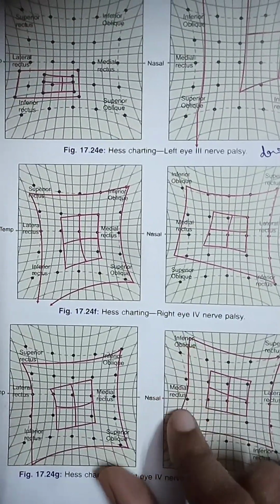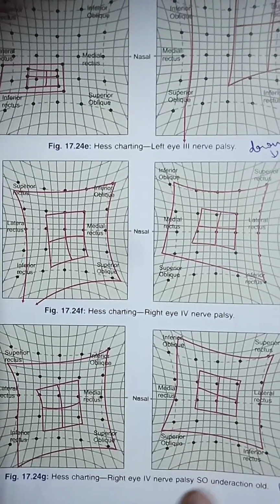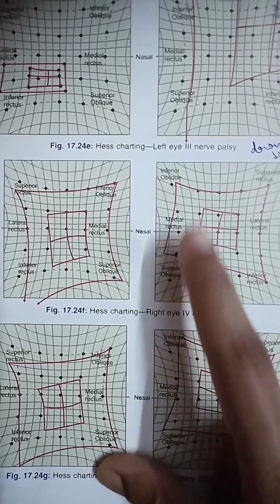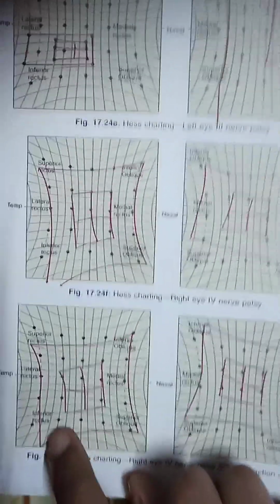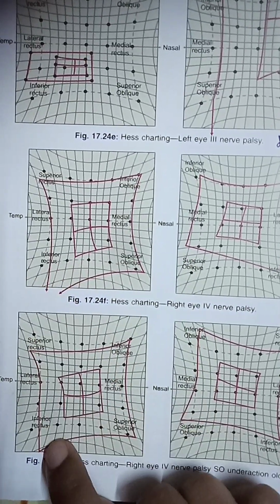And old means late onset. Not late onset, it's more like late phase. So this is superior oblique palsy or fourth nerve palsy. Ipsilateral contracture is not seen here. Contralateral synergist overaction is seen here and here, in the acute stage and in the late stage.